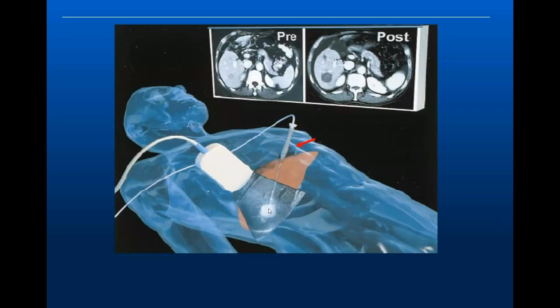Good thing that we are also radiologists, so we can monitor what we are doing either using ultrasound or CT or even MRI now in places where they have MRI compatible devices. So let's start talking about these modalities.